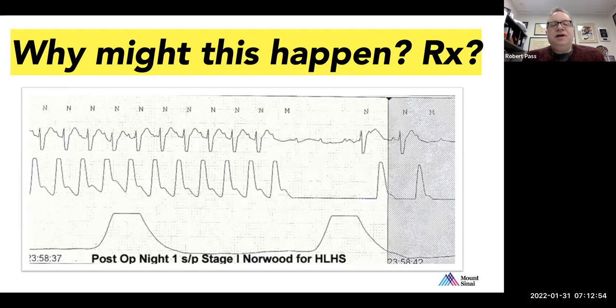What do you think about VVI pacing in a patient who's just had a Norwood? Let's say this happens with some regularity, and we see this maybe every page, 3 or 4 P waves that don't conduct, and you're VVI pacing. What do you think is going to happen to the hemodynamics in this type of patient? So we're at 11:58 p.m. Usually our hypoplast patients come back around 4:30, 5 o'clock. So at this point, the cardiac output should pretty much be at its absolute lowest, right? Because we're about 6 hours from a bypass run.